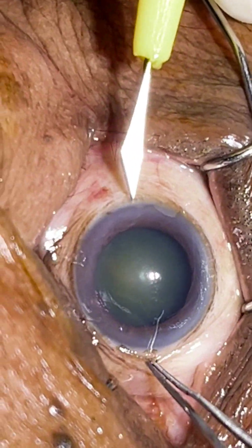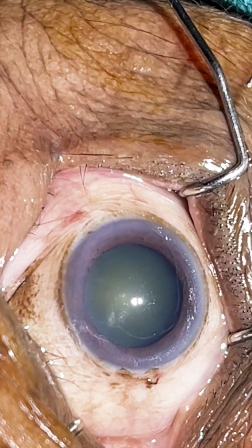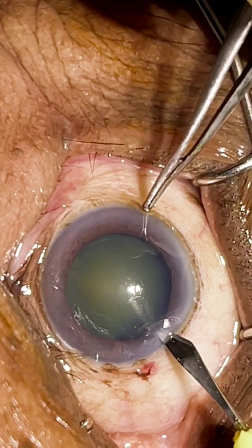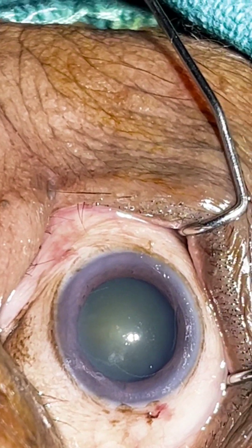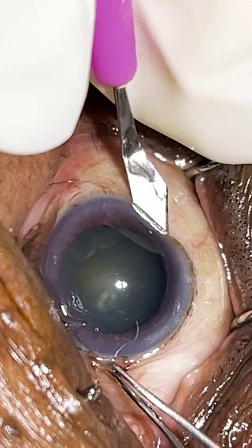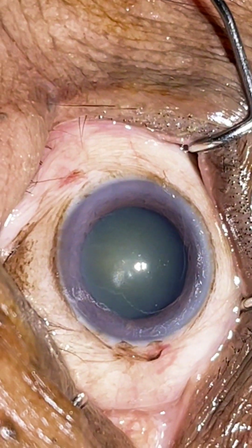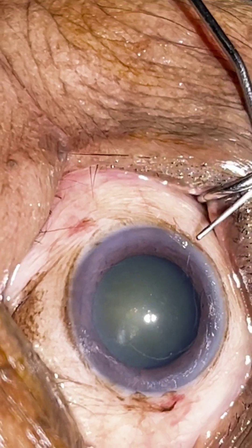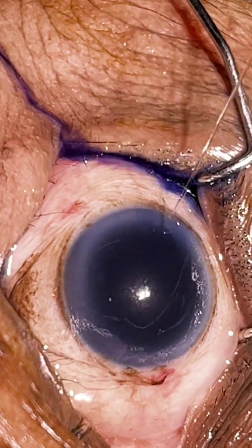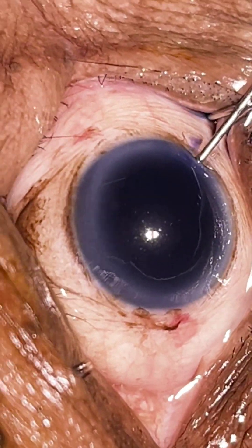This is a case of NS3 to NS4 cataract, but an elastic one. The patient is diabetic, and in such cases the elastic cataracts are difficult to chop. The endonucleus is very very elastic, so even if you get a proper grip to chop it, it doesn't get divided easily because of the elasticity. Chronic or uncontrolled diabetic patients usually present with this type of cataract.